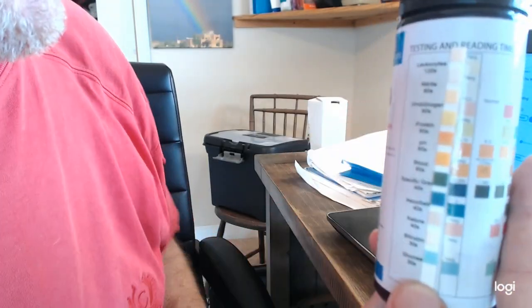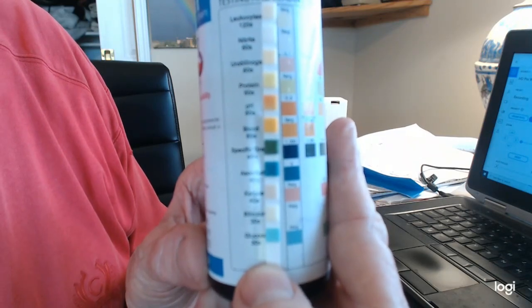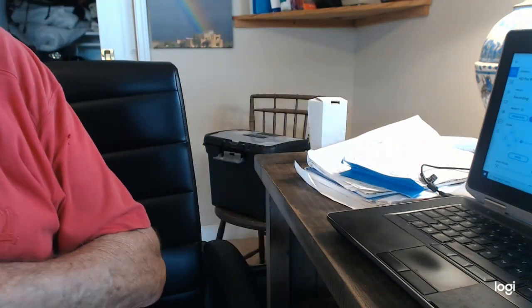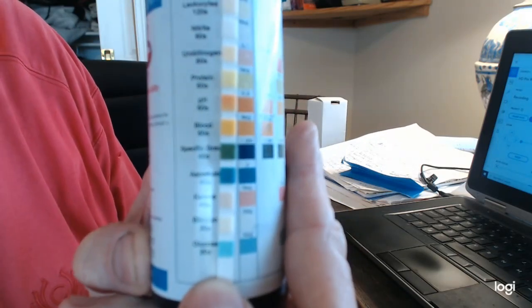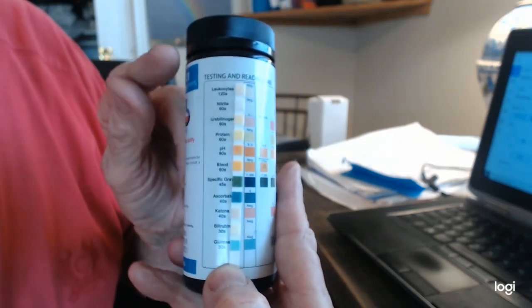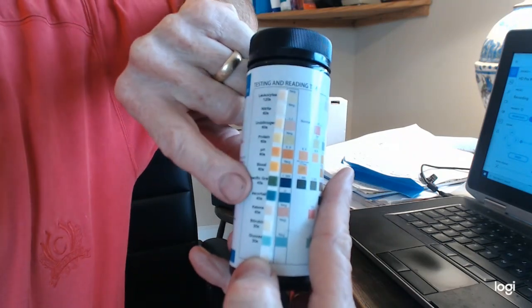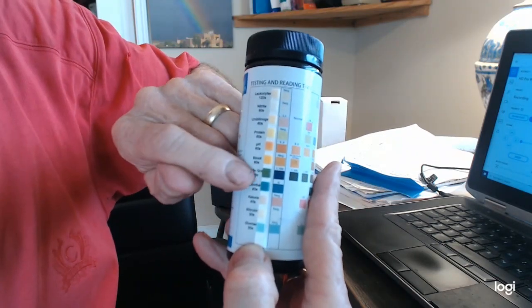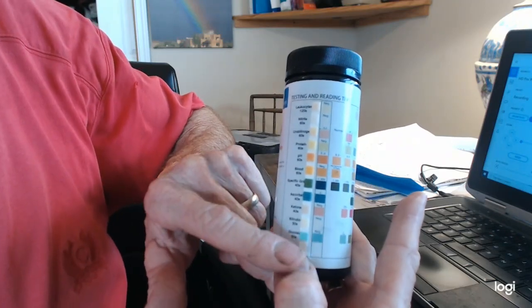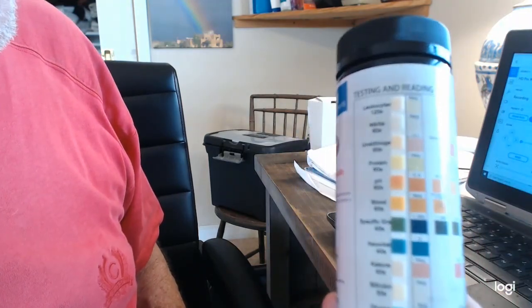Okay, here's my jar. So I can look at these colors, if I can get it to focus. Okay, that's not too bad. So here we have all of the colors, and they're basically the same color as you're seeing next to them. They're not exactly identical, but they're very close to the same color or lighter. You can see this one's a little lighter, excuse my fingernails, I've been gardening all day. And here's glucose at the bottom. It's about the same color. So this is a normal urine sample, and it's coming out about the same colors as the jar.